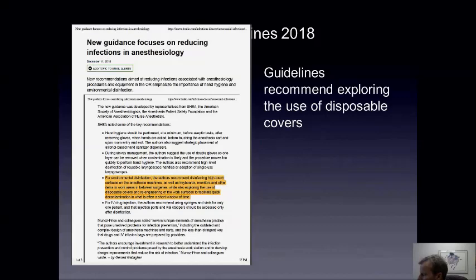Right. So what I think you should ensure when you're talking about the big drape is narrowing it down to contact isolation cases. Usually they may say we wipe it down. They may say we do it at the end of the day. It's not a problem. We have a separate OR for this. We don't see many contact isolation cases. These are some of the usual responses you will have.